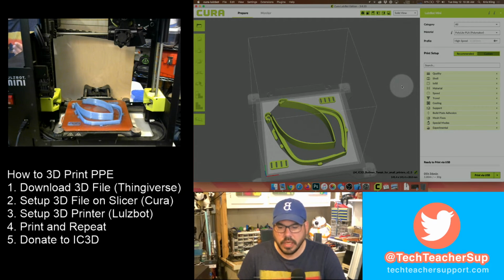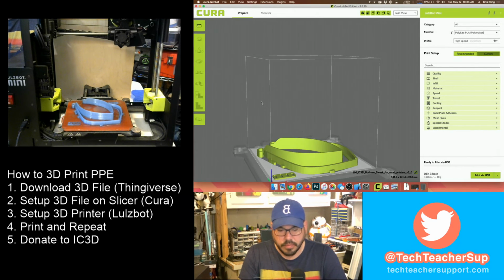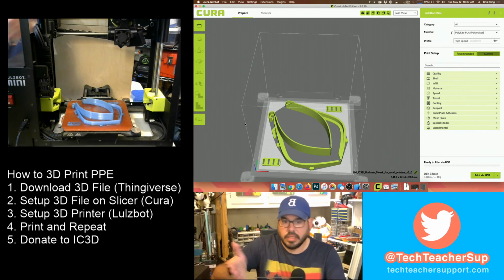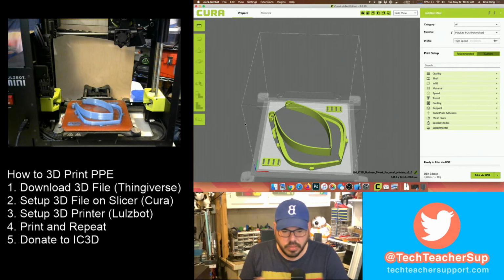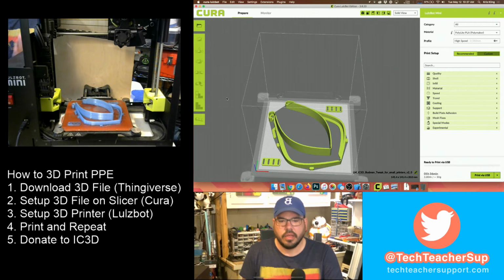So I've already hit Open on the headband and the strap locks, and it has placed them here on the print bed. And we can kind of rotate around and see, but it should look very similar to what's over here on the printer. That's essentially what just printed that, right? So, okay. So number 2, set up your 3D file on the slicer.